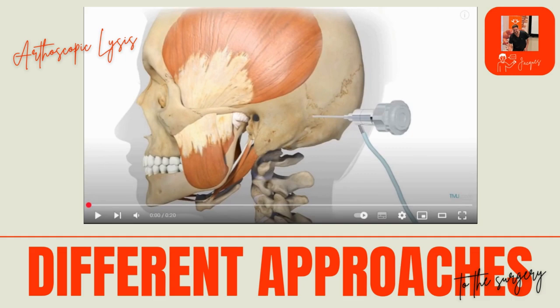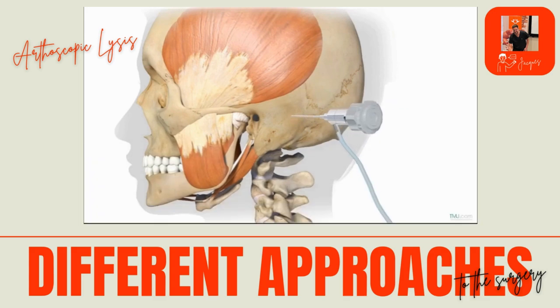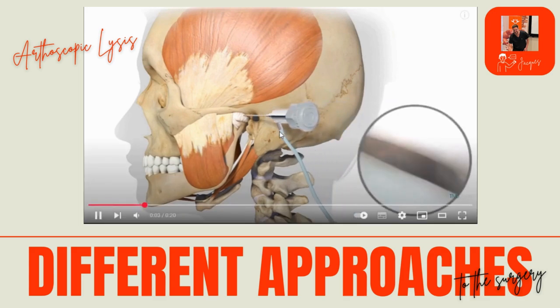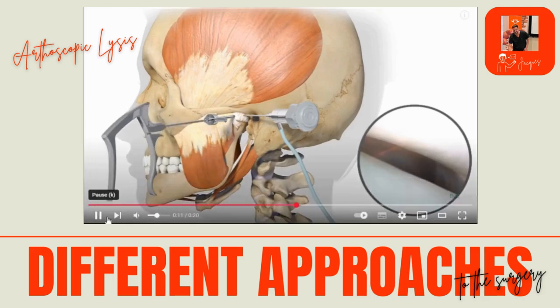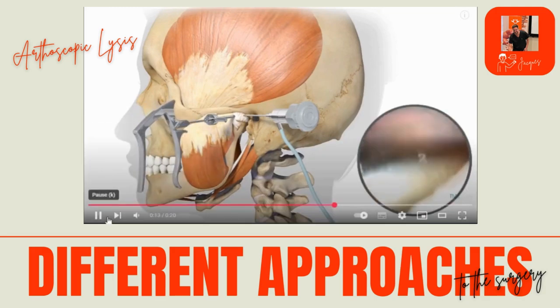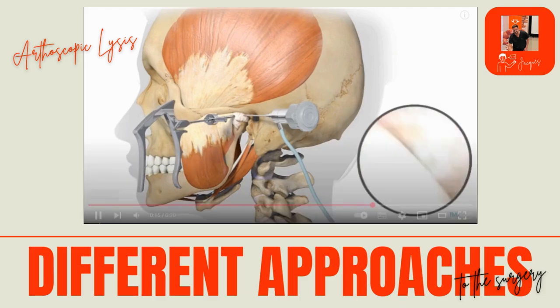The next procedure we have here is arthroscopic lysis and lavage. On screen here we have another 3D reconstructed model of this procedure. An arthroscopic lysis and lavage uses a tiny camera and 2 instruments through 1 or 2 small portals. You can directly see the scar tissue, mechanically cut it out, and then irrigate the area. Recovery is usually fast, and most patients are back to normal within a week or 2.